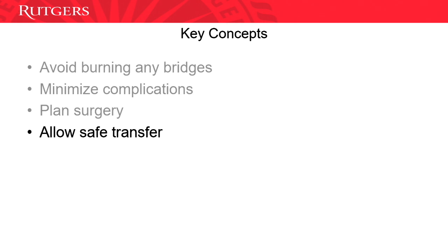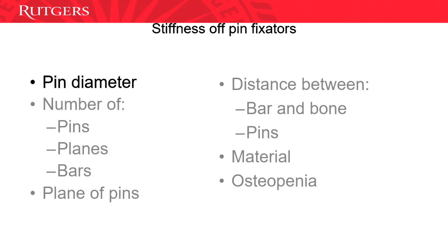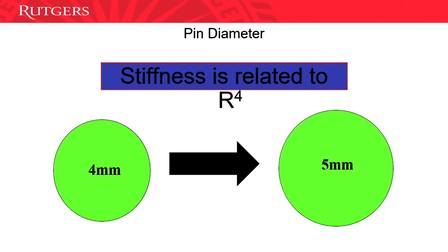And this is what he was talking about. Sometimes if you're not sure how to manage a patient and you might need to do an X-fix, as Dr. Craig said, put the X-fix on so you can transfer it to a trauma center and at least know to try and put the pins away from where the final incision would be made. Stiffness, again, I'll just redo this quickly. Pin diameter, obviously, that's something we've talked about.